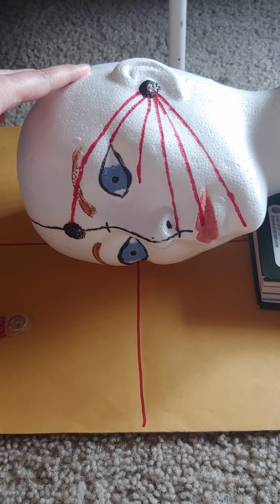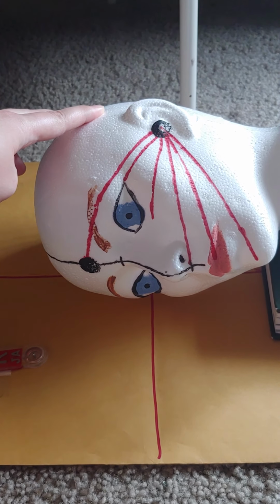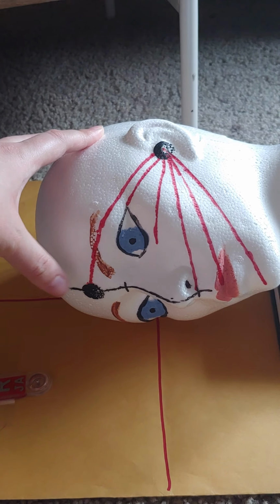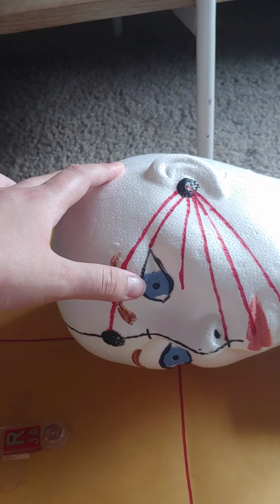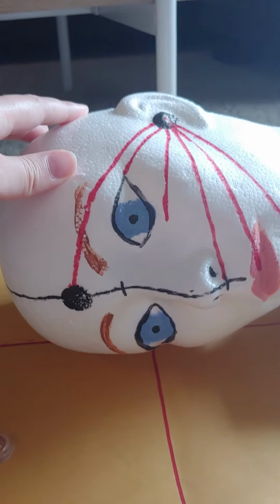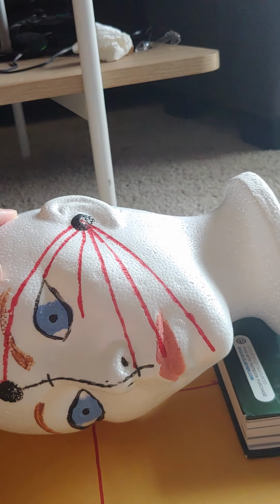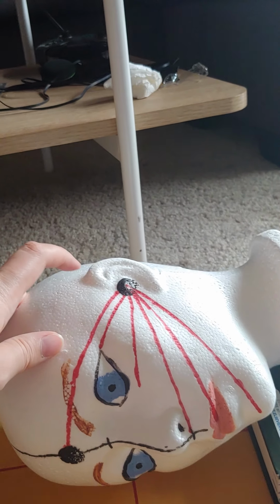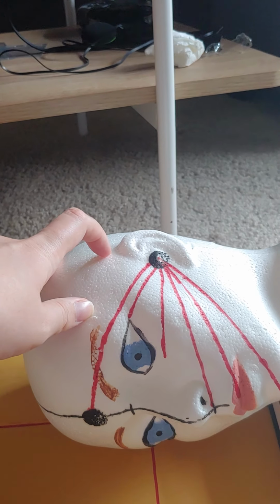This is my lateral skull projection. It's the same as the cross table. You want the MSP parallel to the IR, and you want the interpupillary line perpendicular to the IR. There's no angle still, it's just perpendicular. The entrance point is the same, about 2 inches above the EAM.